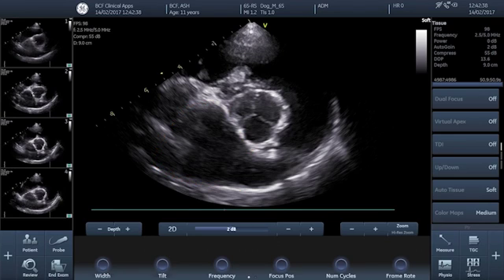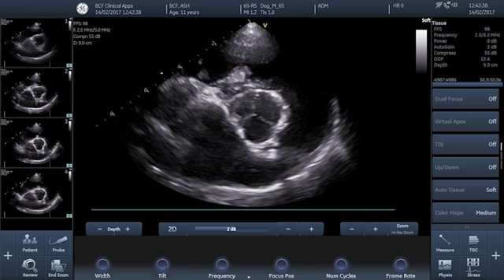In order to make our measurements as accurate, reliable and repeatable as possible it's worth taking some time to optimise the image. In the case of this view the optimisation we're looking for is to make the aorta as circular as possible — you're not going to get a perfect circle, it's more of a three-leaf clover shape, but just try to make it as circular as you can. Make sure you include all of the aortic valve leaflets so that all three arms of the Mercedes-Benz sign are visible, and we also want to be able to see the left auricle forming the tail of the comma below the aorta.